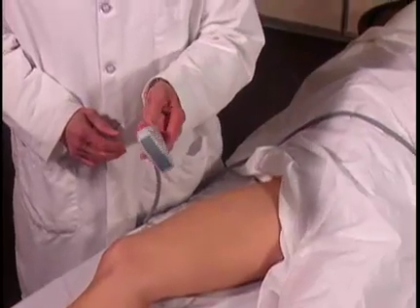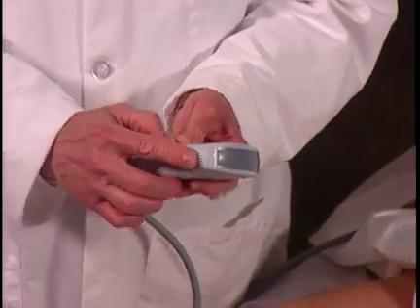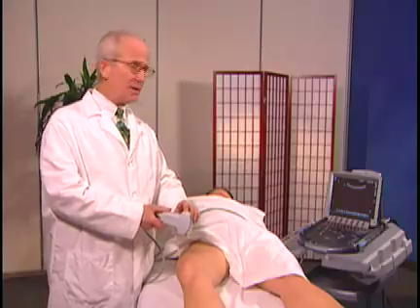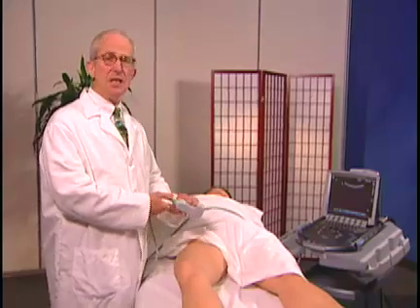I've chosen a C60 transducer. There is a line here which corresponds to the turquoise dot on the screen, and this we usually by tradition keep proximally or medially, and that's the way I'll orient this image.